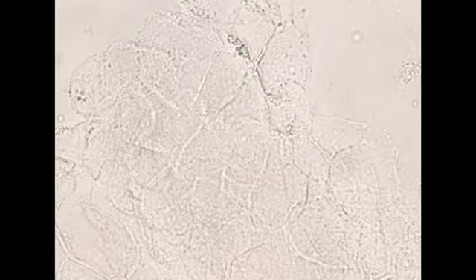Most labs now add a fluorescent stain called calcofluor white to the potassium hydroxide preparation, with subsequent examination of the slide under a fluorescent microscope. Fungal elements will appear as bright yellow-green fluorescent hyphae as the calcofluor white binds to the chitin in the fungal cell walls.